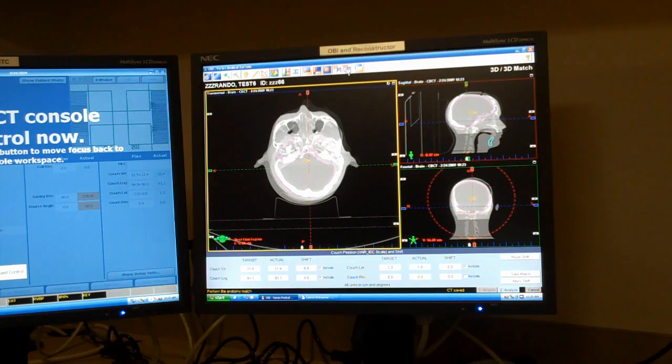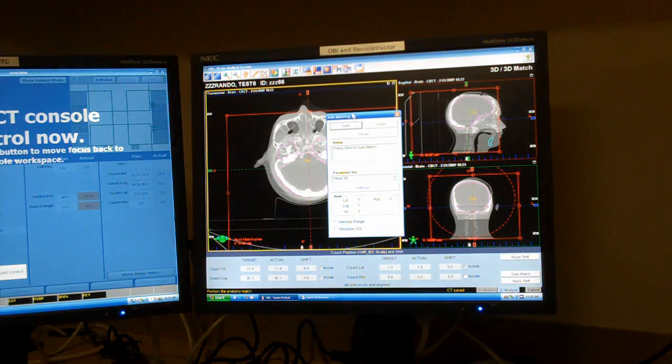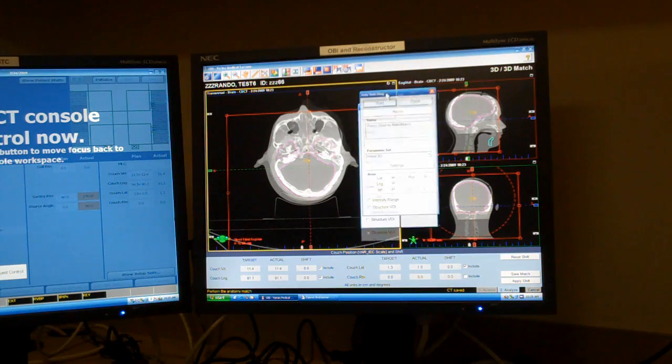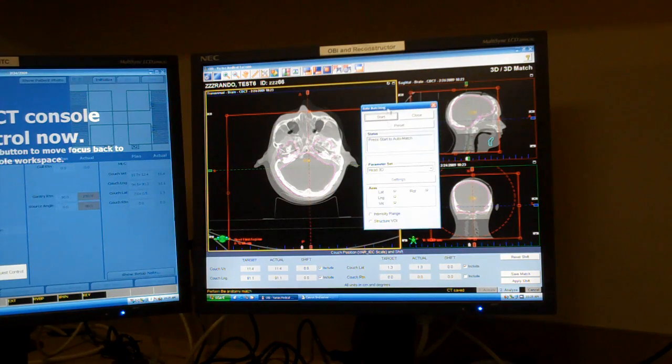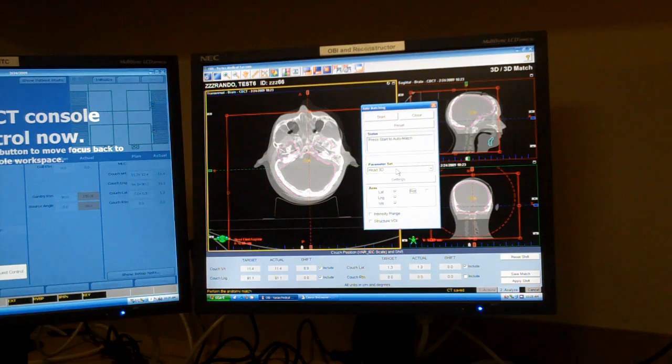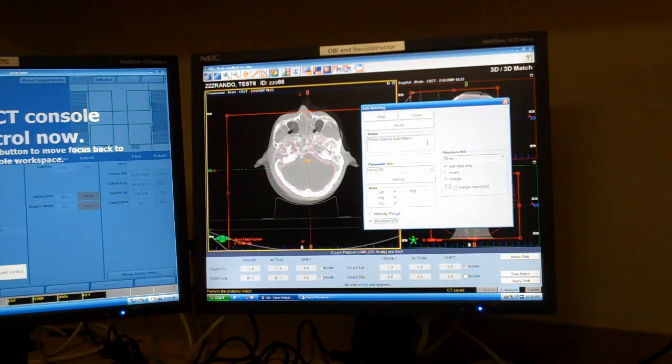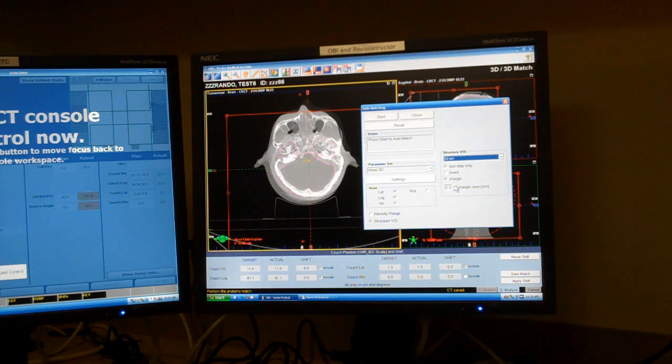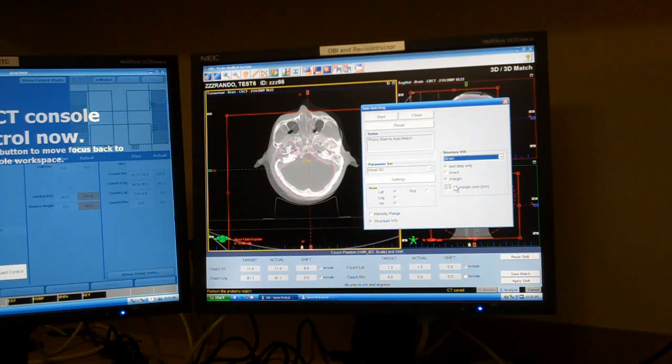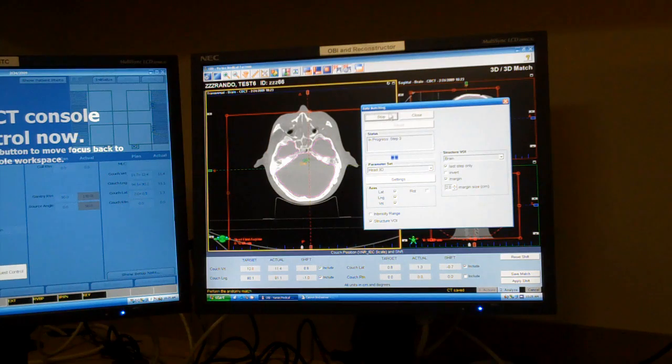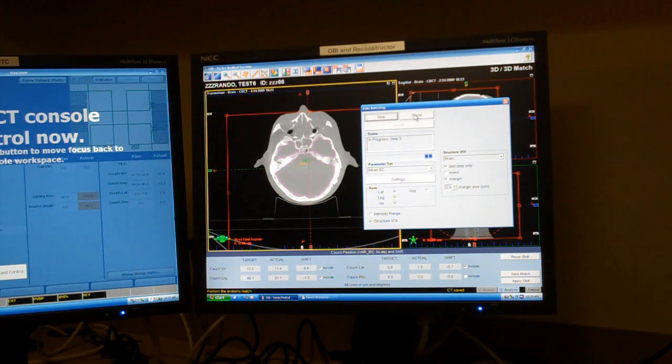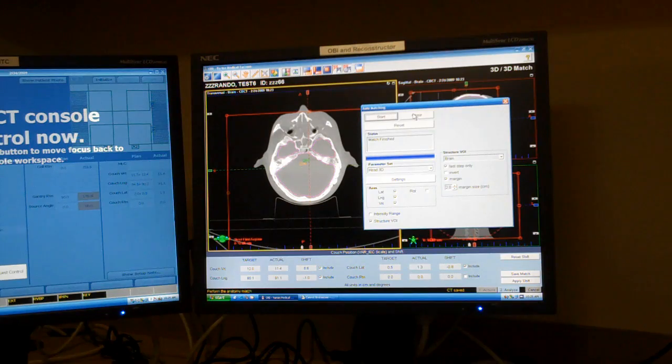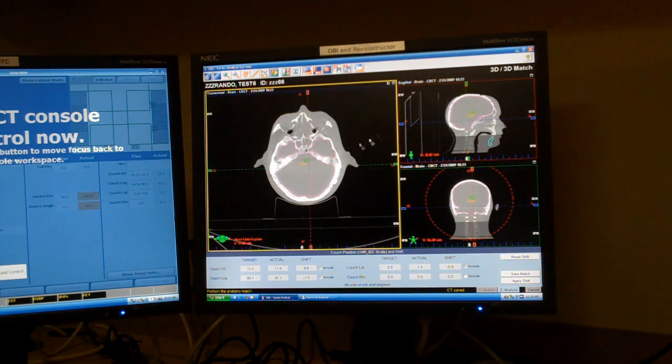Here, we can do an auto match 3D. It will give us several options. You can see the red Rigid box. I don't want rotation. I can choose just the brain ROI, plus maybe 2cm in margin, and tell it to go. And you can see it immediately snaps into a very good shift.